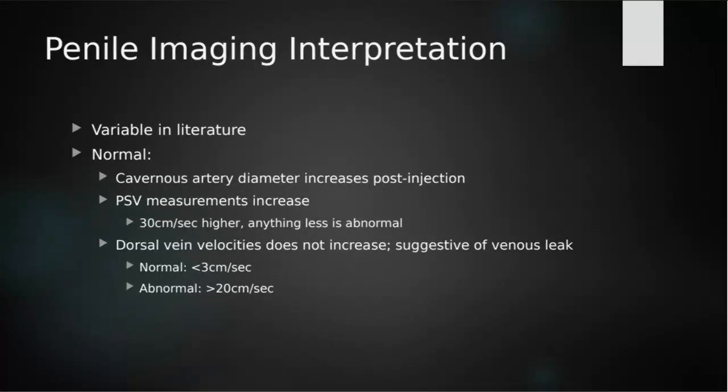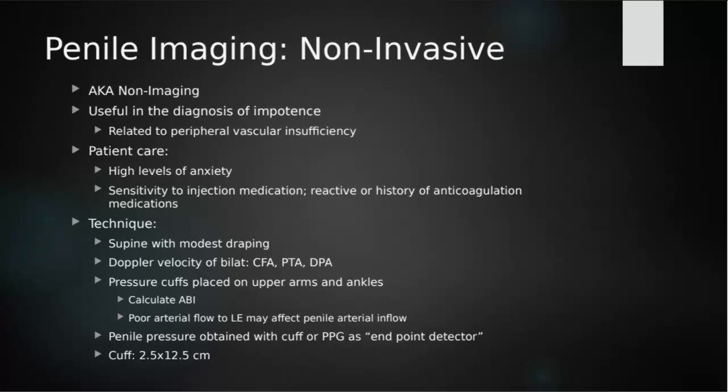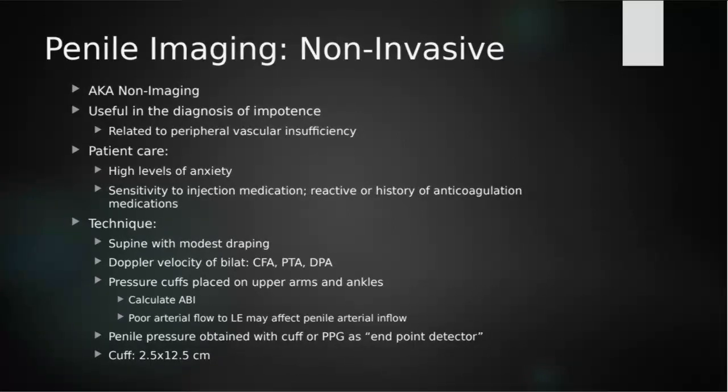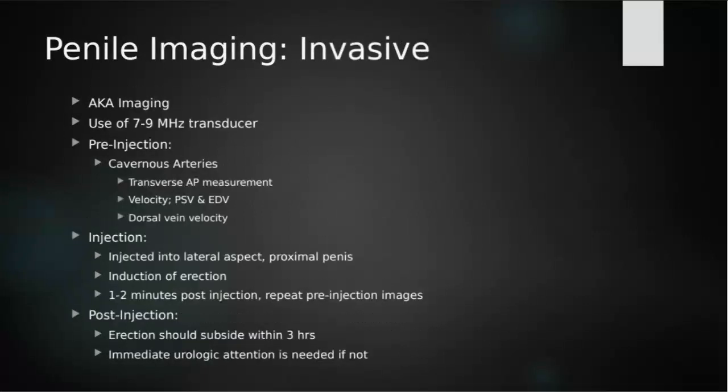Hold on, guys. This patient care section is obviously talking about both types of penile imaging. We don't do injections with non-invasive penile imaging. The only reason I got confused on that is because I've only ever done the injection. So we're not injecting with non-invasive, which would make sense. In non-invasive, we're just relying on those waveforms and those pressures. And then for invasive, of course, we are injecting, waiting, and then repeating those images afterwards.